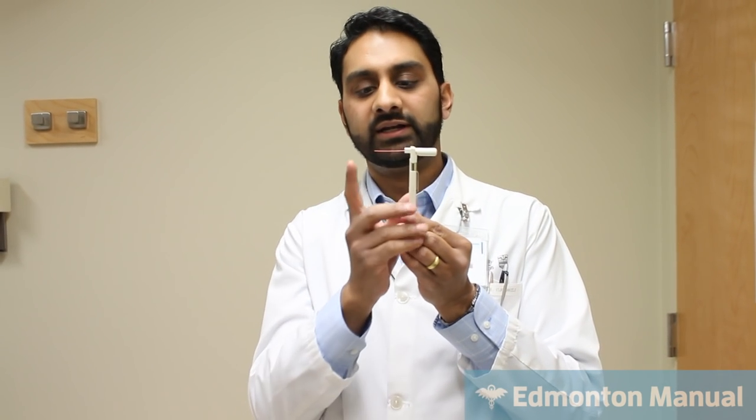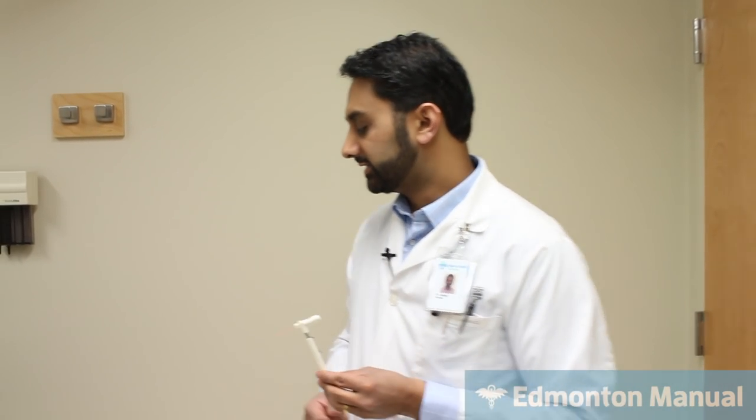One of the key things about the monofilament is you actually should let it rest between patients. I know that sounds odd, but they're fairly well calibrated so that it takes a specific amount of force to actually bend it. Okay. So you shouldn't be using it patient after patient after patient, and usually you're not, because you're not usually seeing a bunch of people for a diabetic foot exam, and if you are, you should maybe have multiple ones of these.